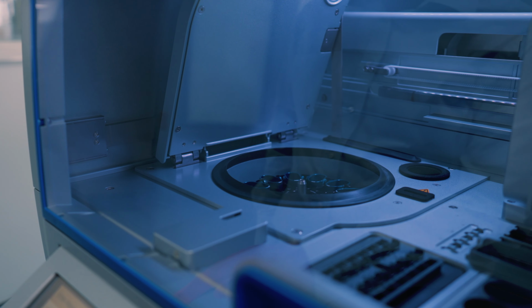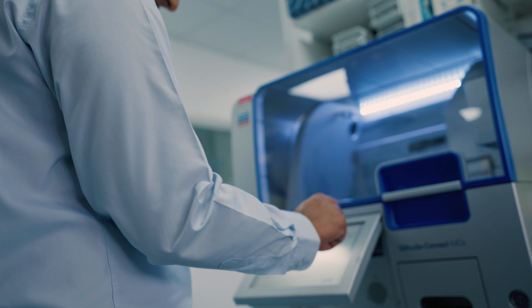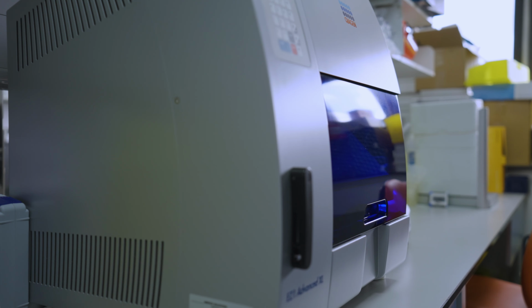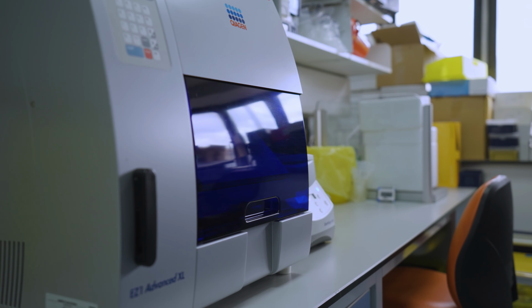The other advantage of the technology is that it moves us into Build 38. There's a transition going on in our lab at the moment of moving all our gene panels from Build 37 to Build 38. So I think for our sensitive assays for monitoring, it may be the sequencing chemistry of choice for us at the moment.